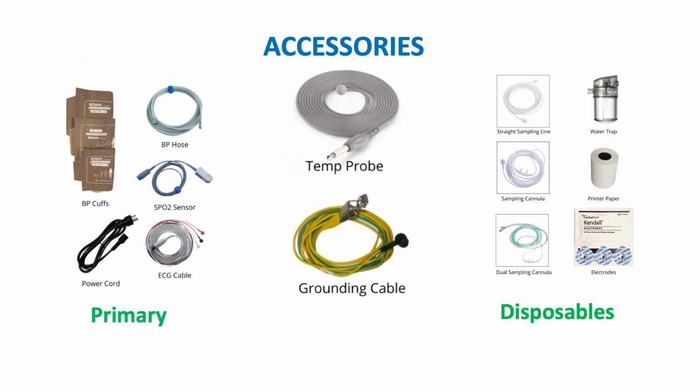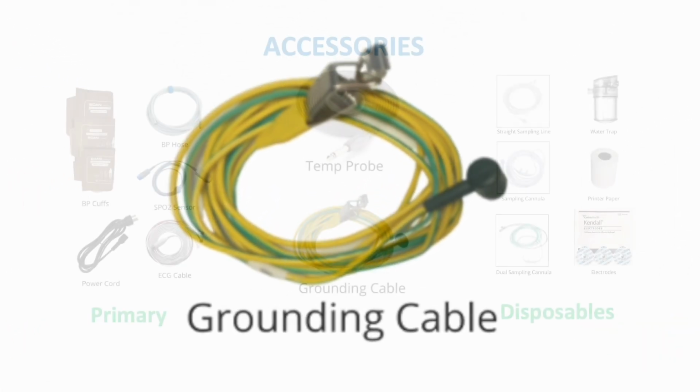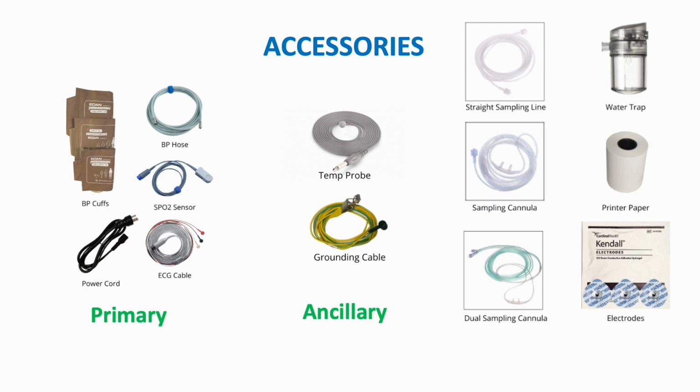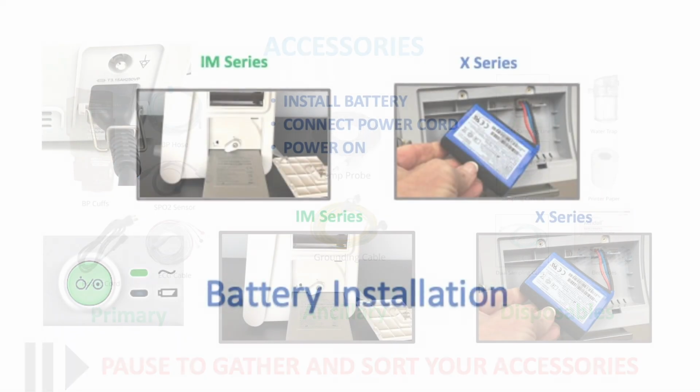However, if artifact appears on the ECG waveform, the grounding cable can be used to troubleshoot potential issues with electrical interference. Disposables include the CO2 water trap, various CO2 sampling lines, printer paper, and ECG electrodes. Before we begin setting up the accessories, pause and sort the accessories as shown.